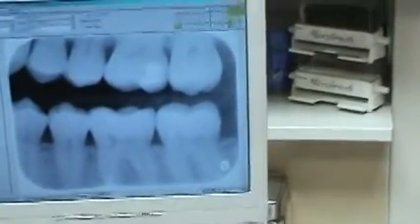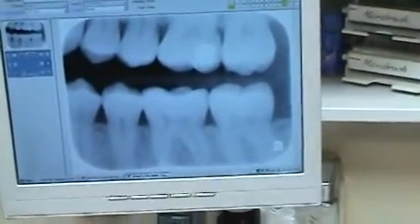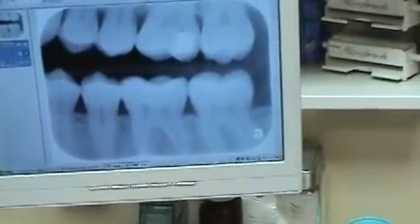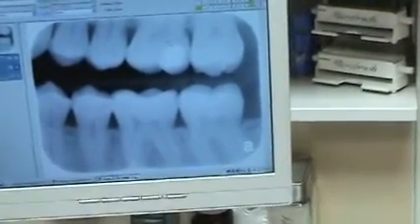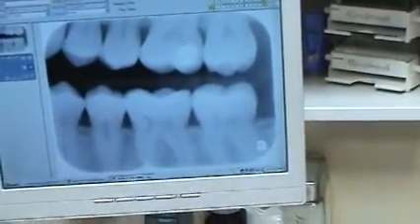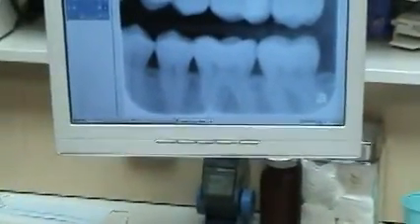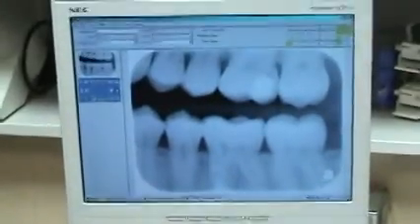So when I look at a radiograph, if I see something that looks a little different, that's a filling. And she's actually lucky because we can tell that it's fairly close into the nerve. If it had only gone just a tiny bit further, she probably would have needed a root canal and a crown instead of just a filling. So that's why it's important to visit your dentist every 6 months to a year, so that if you have a cavity, it doesn't get big and end up causing you big problems. When we catch them when they're smaller, we can more often than not take care of them as opposed to getting into bigger issues.